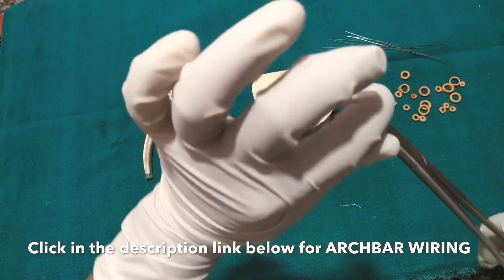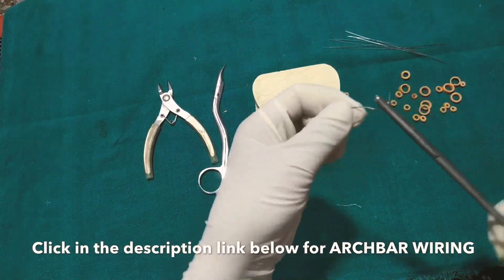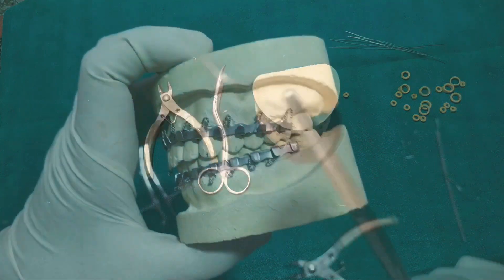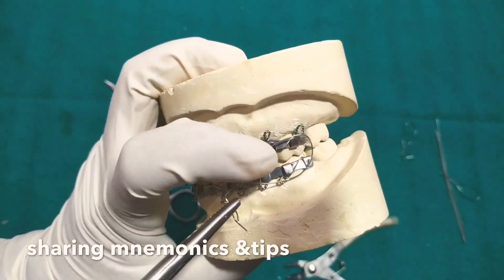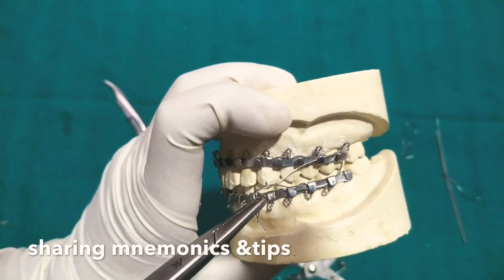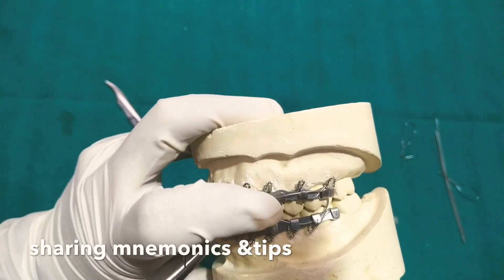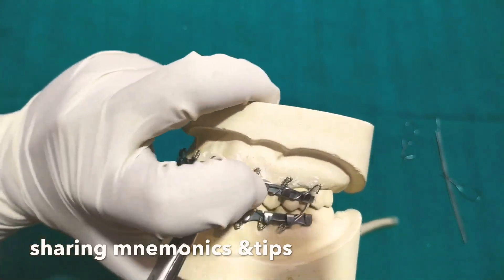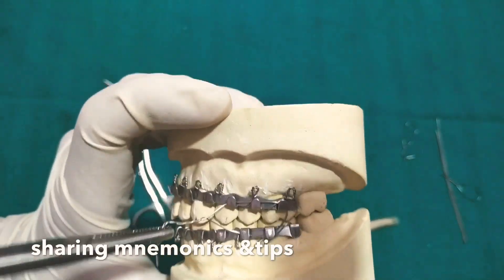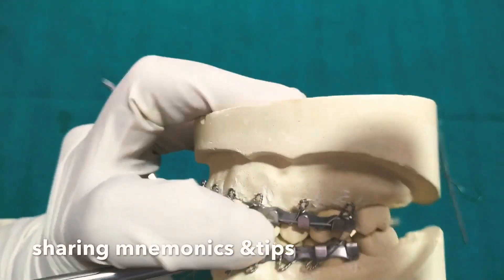Make a loop in this way and twist the wires. For easier adaptation, for all the wires, make a loop in this way and twist the wires. You may take two hooks above and two hooks below, as you can see in the video, or you may take three hooks on top and two hooks below — it's up to your convenience, whichever way you prefer.